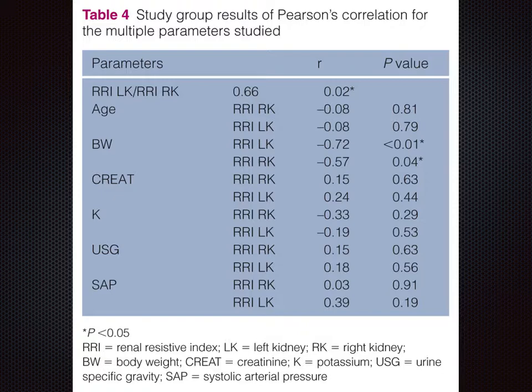No correlation was achieved between the RI and the studied parameters. However, it was possible to establish a negative correlation with body weight, a moderate correlation with the right kidney, and a strong correlation with the left kidney.